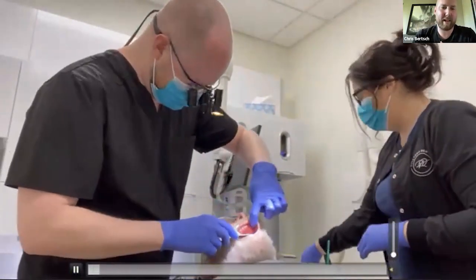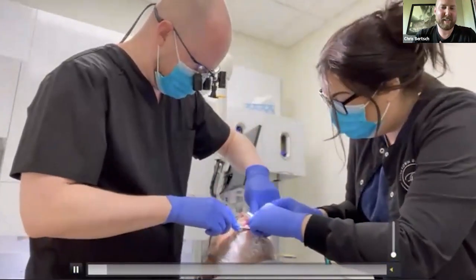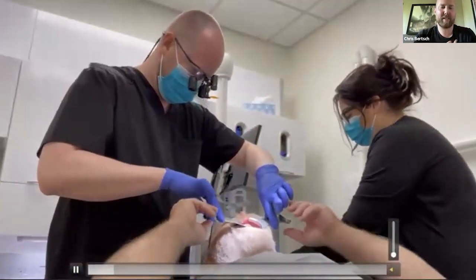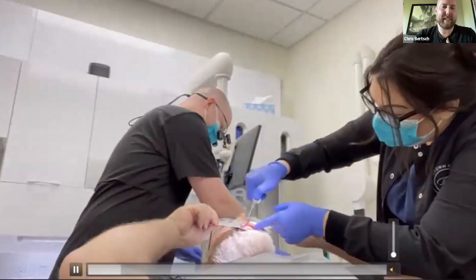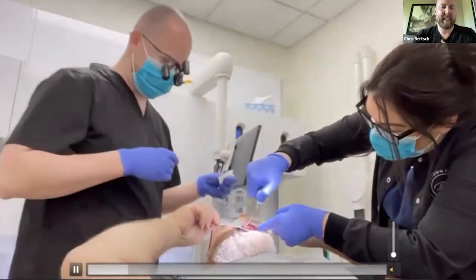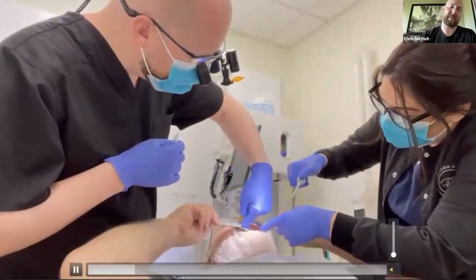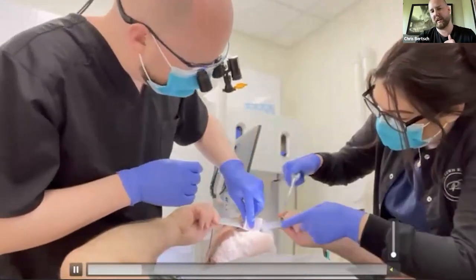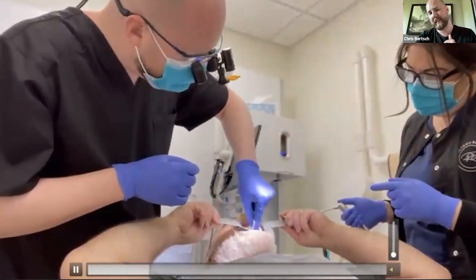So camera head's 10 pounds. Keep that in mind. And we start with cheek retractors, get the patient's cheeks out of the way, and then we get the patient to hold those. And then we dry all the tissues off, air dry and gauze. Rather uncomfortable for them. And also I explain everything before we do it to the patient. We're like, okay, this is what we're going to do. So they're aware of it.